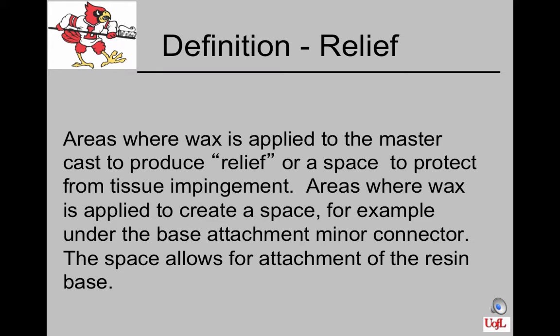After blockout is completed, relief must be applied to the master cast to produce relief, or a space, to protect from tissue impingement. Areas where wax is applied to create a space, for example, are under the base attachment minor connector. This space creates room for acrylic resin to flow under the base attachment to lock on the teeth and denture base. It's also placed under the mandibular major connector and under the approach arms for bar clasp.